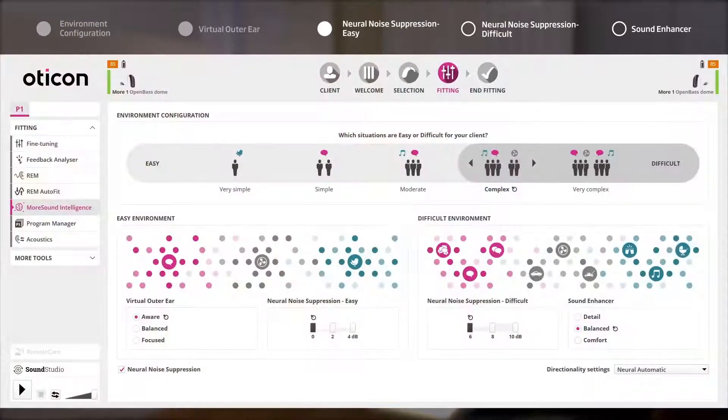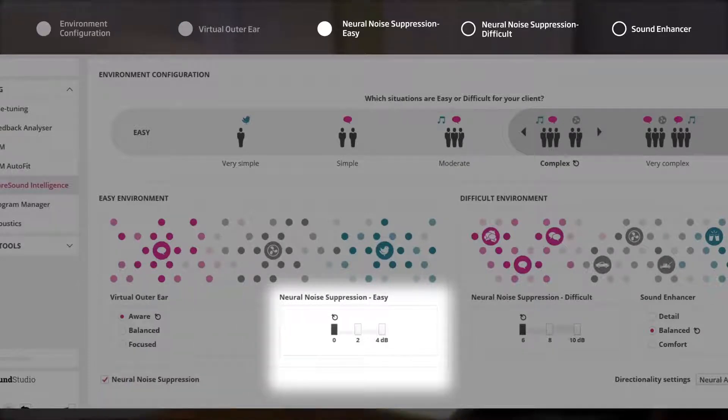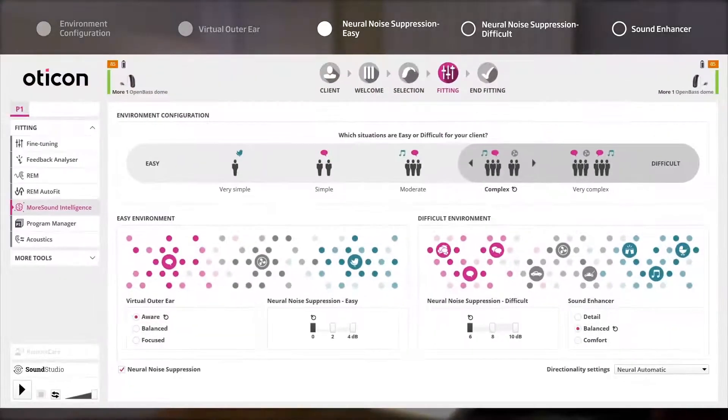If the listening situation is deemed easy, spatial cues are recreated by Virtual Outer Ear followed by Neural Noise Suppression. In this client's case, no noise suppression will be applied in easy situations.